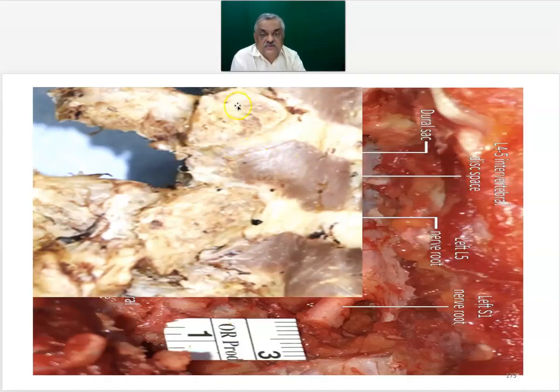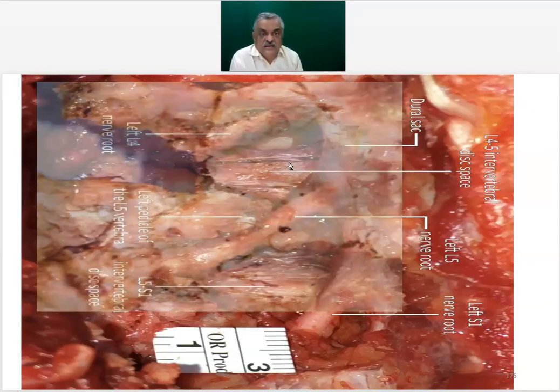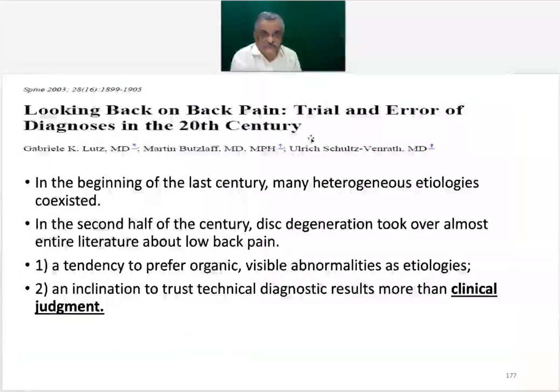There is a ligamentum flavum, there is a pedicle, and two images have been superimposed as you can see here or here, and you will find that this is the nerve which is coming out, there is the pedicle above, there is a traversing nerve where there is a ridge, there is ligamentum flavum in the center, there is a lateral part of the ligamentum flavum, and here you can see very clearly there is the axilla, there is the disc, there is the axilla here, and what we are dealing with is the tissue which is lying here in the roof, which is the ligamentum flavum.